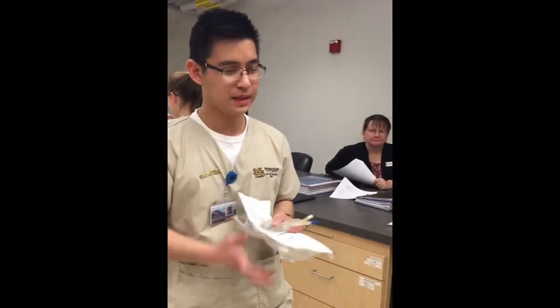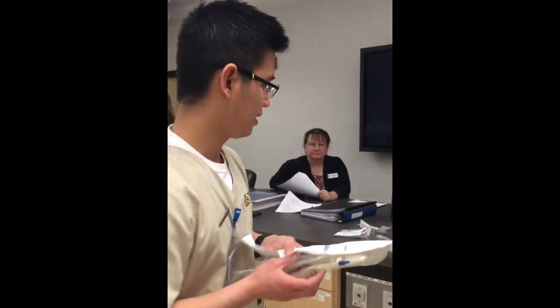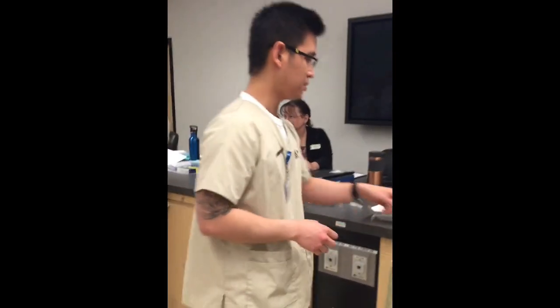Come in. Hi, my name is Michael Archer, and I'm at the University College, and I'm here to set up a B-Retrol for my patient. Okay, can you say his name and date of birth for me, please? Sure, it's Harry Potter, 6-25-2013.